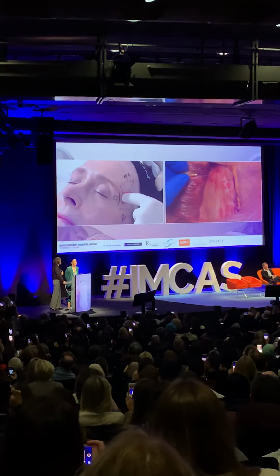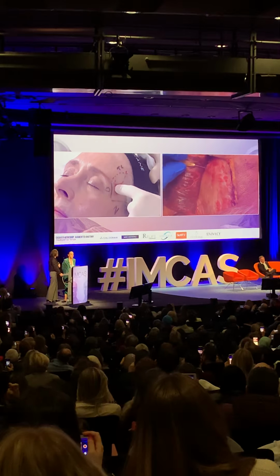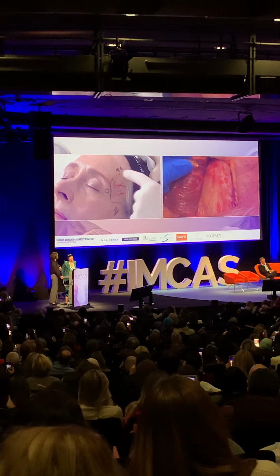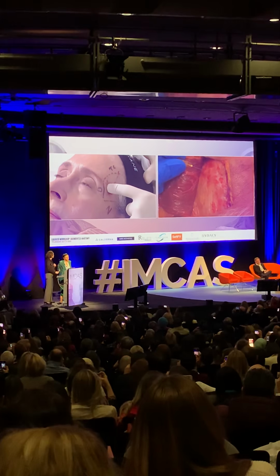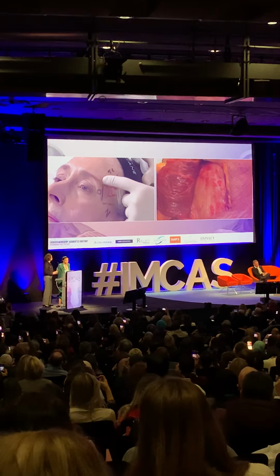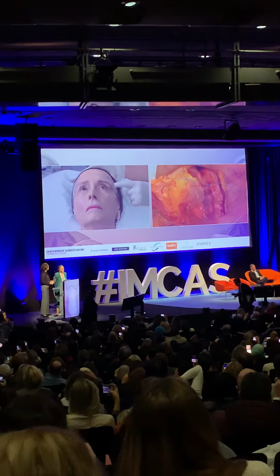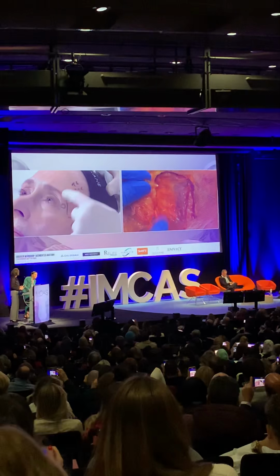And then I will be perpendicular to my temple. It's a very safe injection. And after, you do not need a strong massage, because the muscle that will be above your product will give a massage, and it's for that during the 2 days after this injection, your patient, when she will eat or chew, she will feel a little pain when you do a deep bolus injection in this area. This is for the technique.